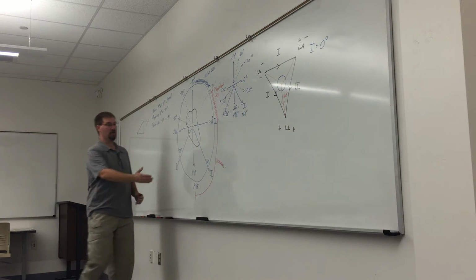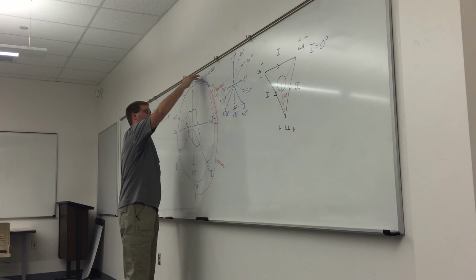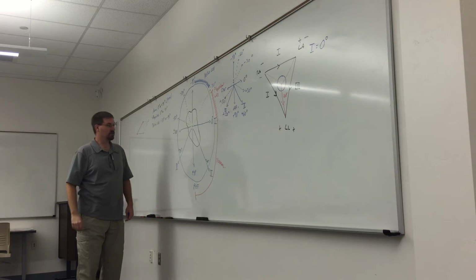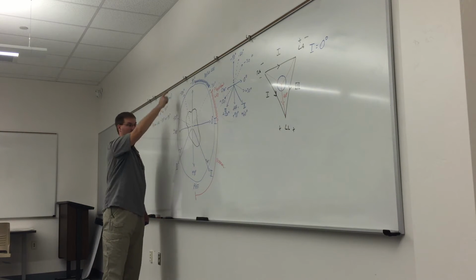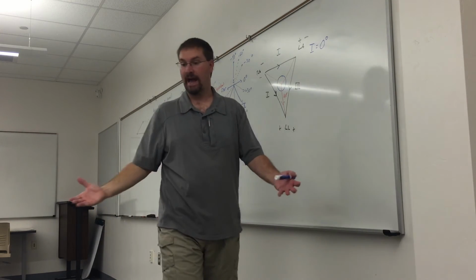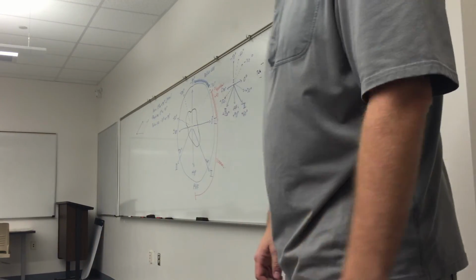Okay, so we've got normal, physiological LAD, and pathological LAD, or left axis deviation. All right, so let's now talk about right axis deviation, which is in this area here. So let's just talk about your run-of-the-mill right axis deviation, okay? And that's going to be, what do you suppose?